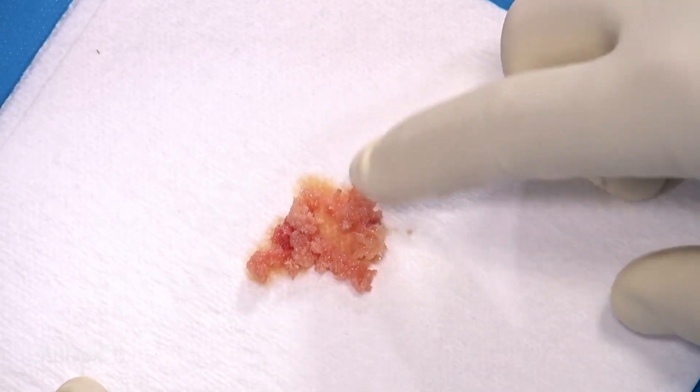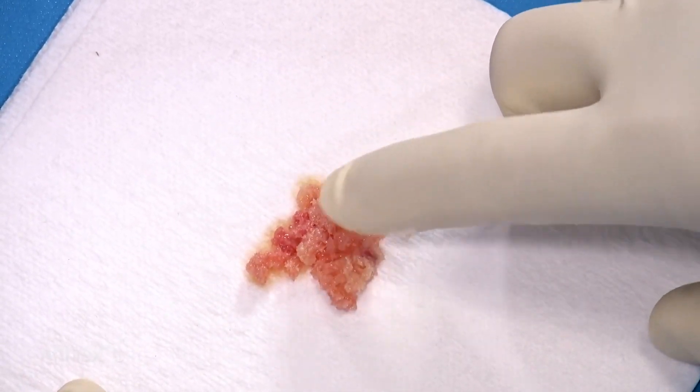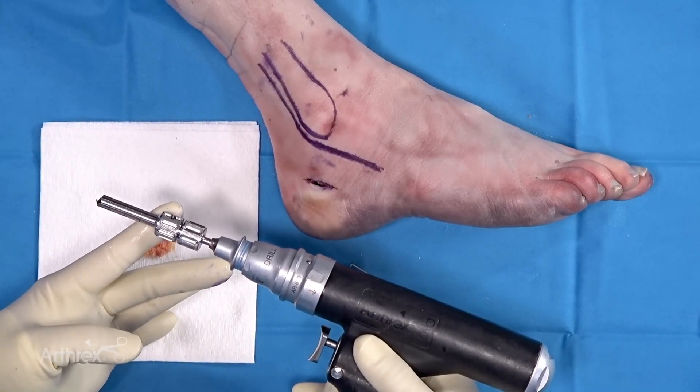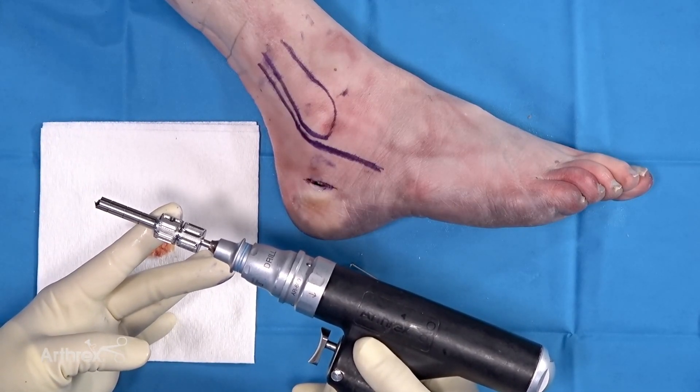When we look at the consistency of the graft, you can see it's nicely morselized, good quality autograft. If more bone graft is needed, additional passes can be made through the same corticotomy in the lateral calcaneus.